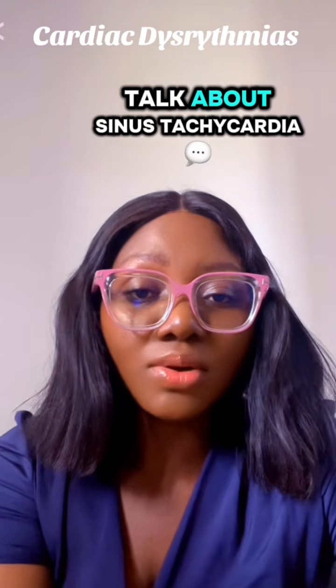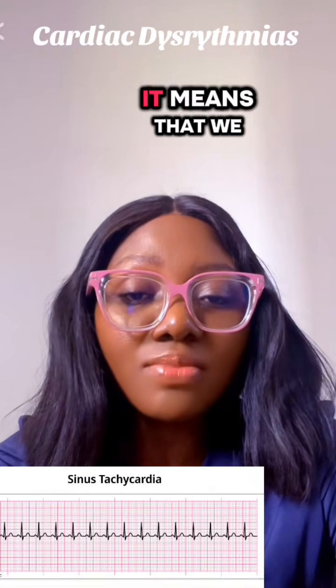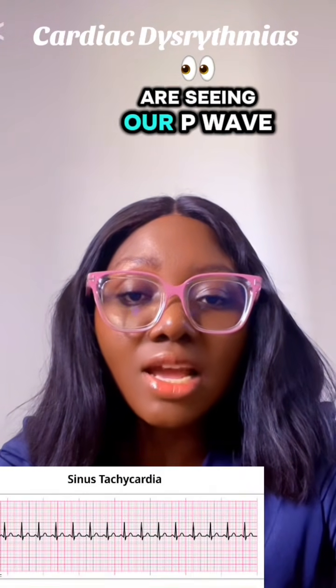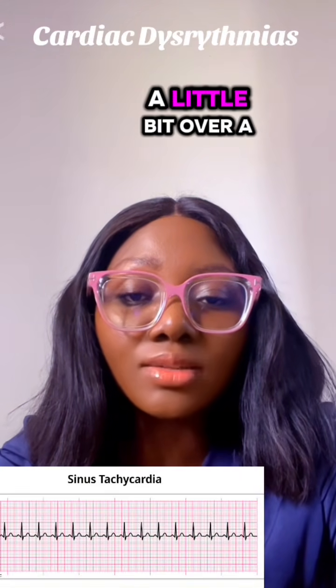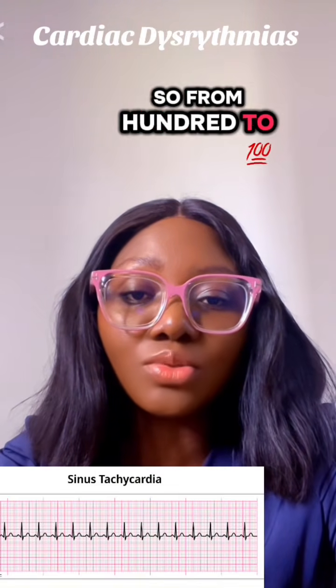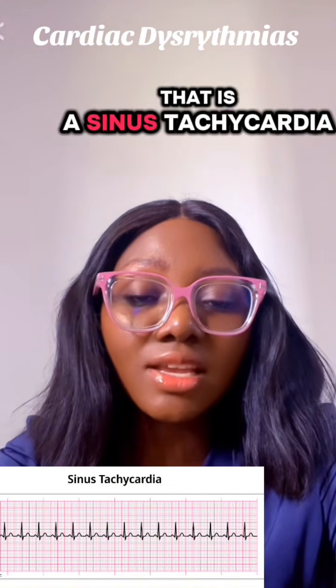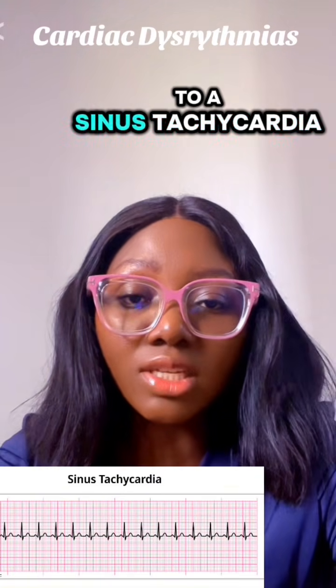Now, for you to talk about sinus tachycardia. So for sinus tachycardia, it means that we are seeing our P wave, our QRS complex, our rate is a little bit over 100. Okay, so from 100 to 150. That is a sinus tachycardia. Many factors can contribute to a sinus tachycardia.